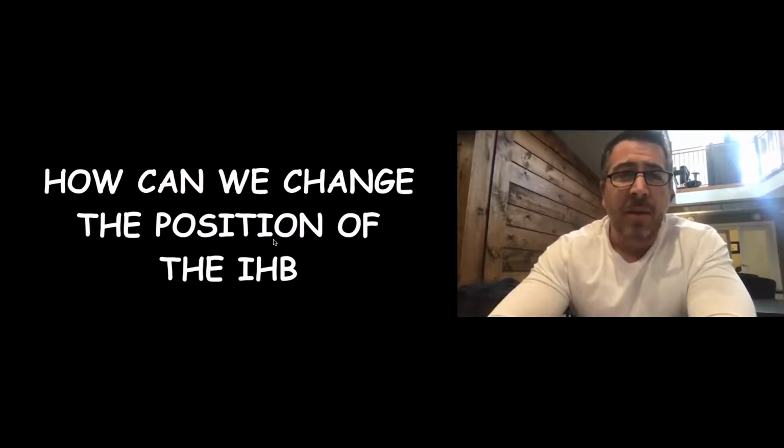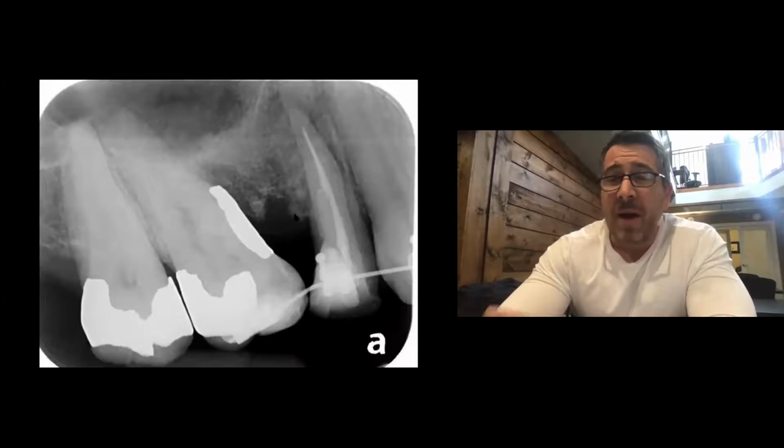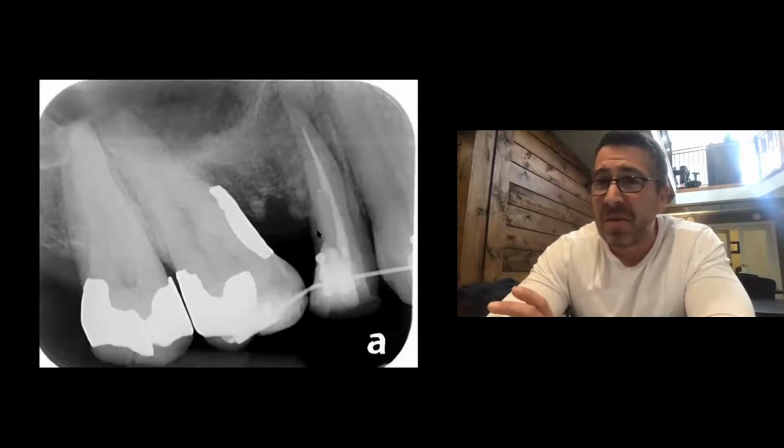So interdental height of bone is huge. Can you change the interdental height of bone? The only way I know to do that is through ortho. So I'm not a big ortho person. I respect the orthodontist and I send it out. There's the odd case that we'll do in the office just from a costing point of view sometimes.